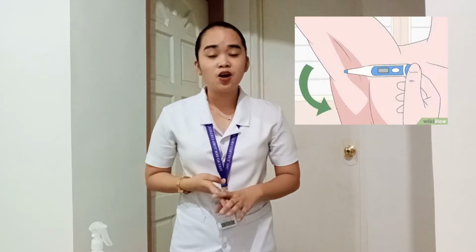So the first assessment that we're going to measure is the body temperature of our patient. Body temperature is important as it reflects the balance between the heat production and the heat loss of our body. There are a lot of sites where we can obtain the measurement. It can be temporal, oral, rectal, axillary, or at the tympanic membrane of our patient. But for today, I'm going to measure the body temperature of my patient using the oral and axillary sites.